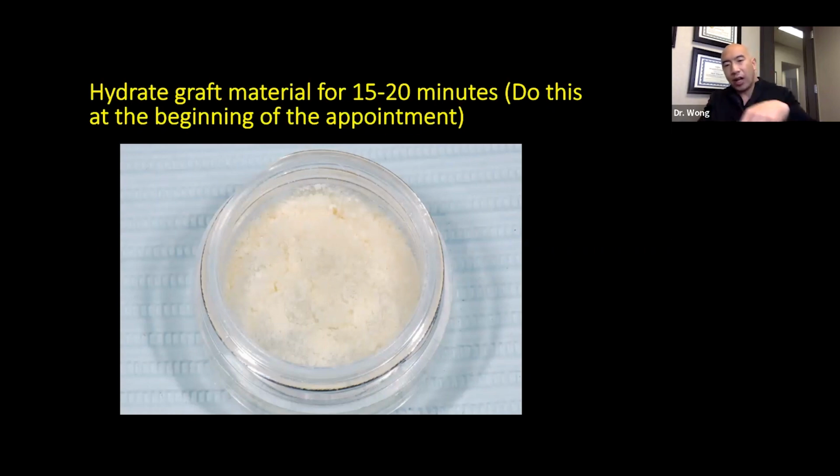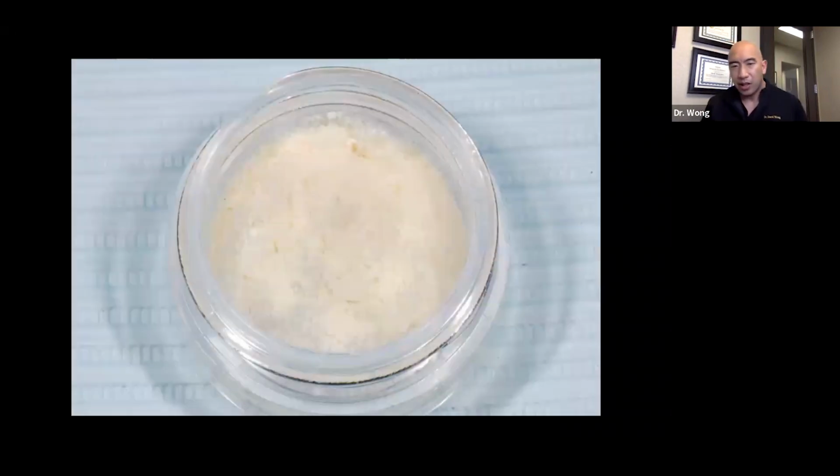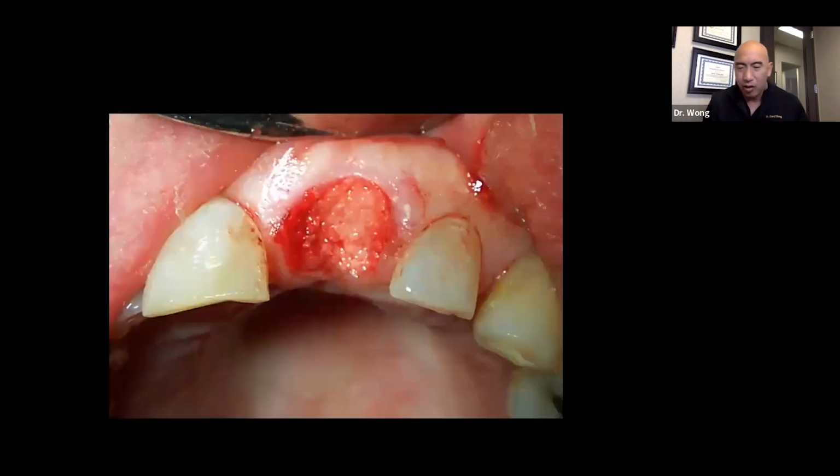Be sure you stir it around though, because if you just dump water in it, only the top part of those particles will get hydrated. It doesn't get to the bottom, so you've got to stir it around really well. You're going to do that, and let it sit there for supposedly 15 to 20 minutes. That's ideal. If you go in too early, then it gets kind of dry. It's hard to work with. So make sure that you hydrate it for a recommended time of 15 to 20 minutes.